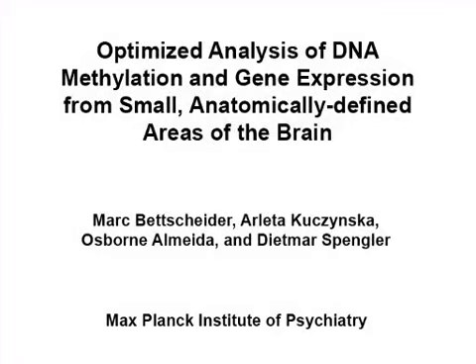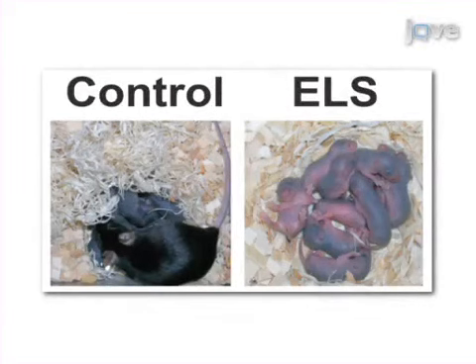The overall goal of this procedure is to study DNA methylation and gene expression changes upon early life stress. This is accomplished by first subjecting newborn mouse pups to maternal separation to induce early life stress.